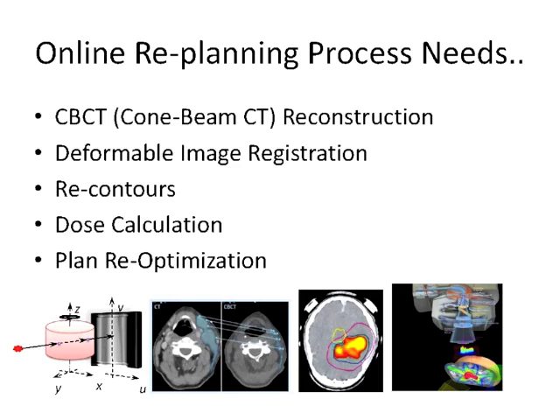And then we have to do the deformable image registration. It was the same tumor, but days have passed, and the patient's lying position is different. We have to know exactly where the previous tumor is now, corresponding to the tumor today when the patient is on the bed. So we have to match that. That's image registration.